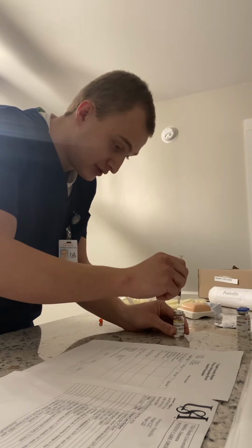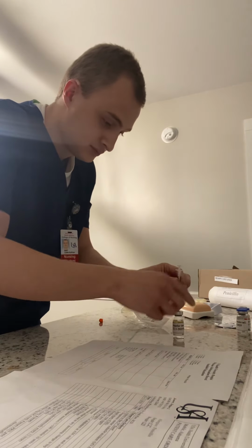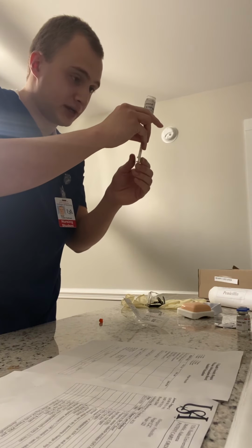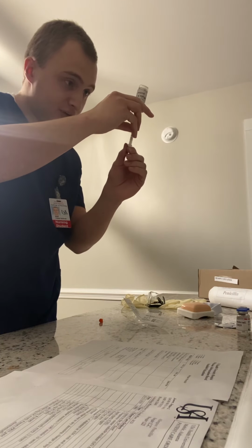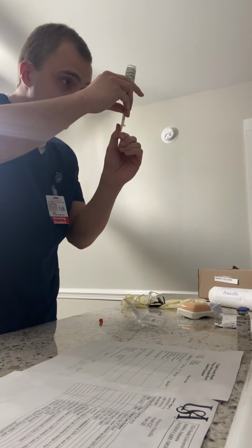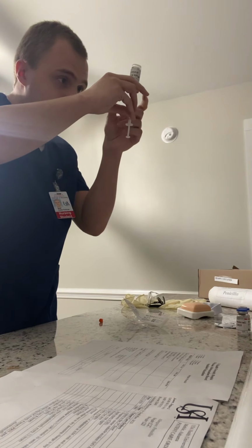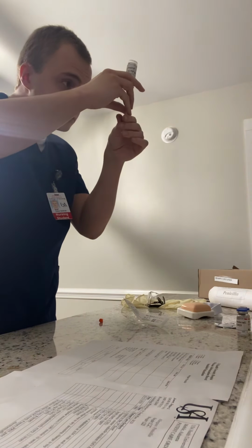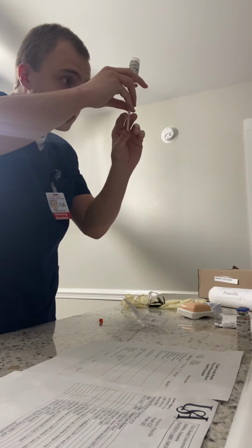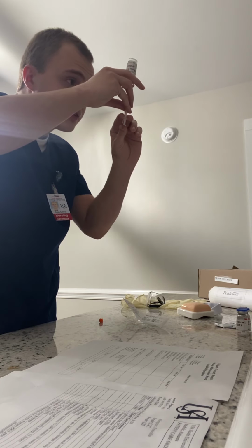I will now insert my syringe into the vial, releasing the air. And I will now draw back more than 10 units of insulin. This way I can remove any air bubbles. And then I will return the amount to 10 units.